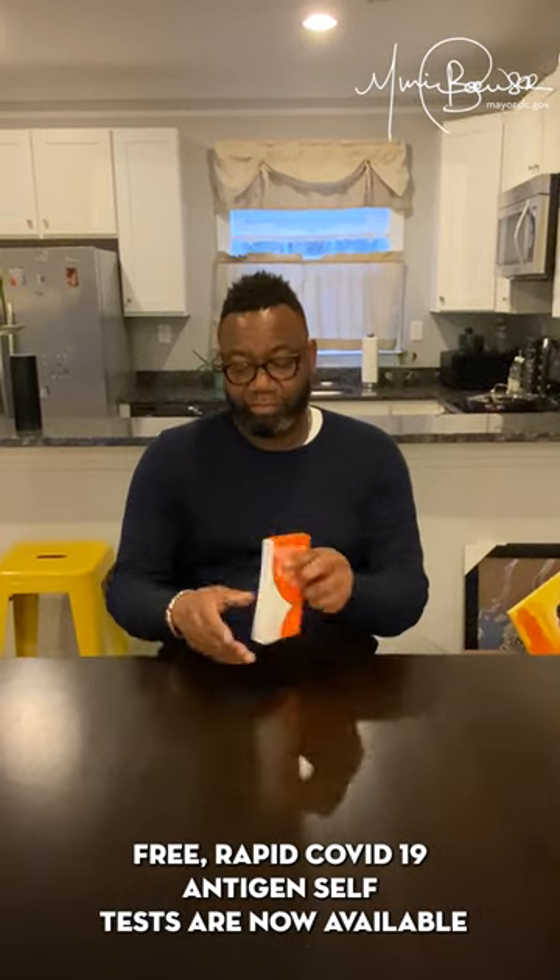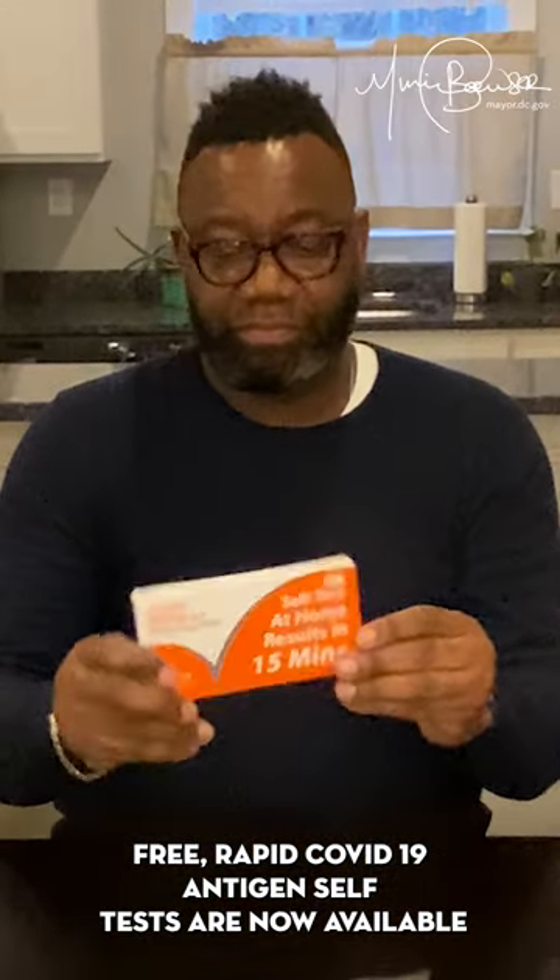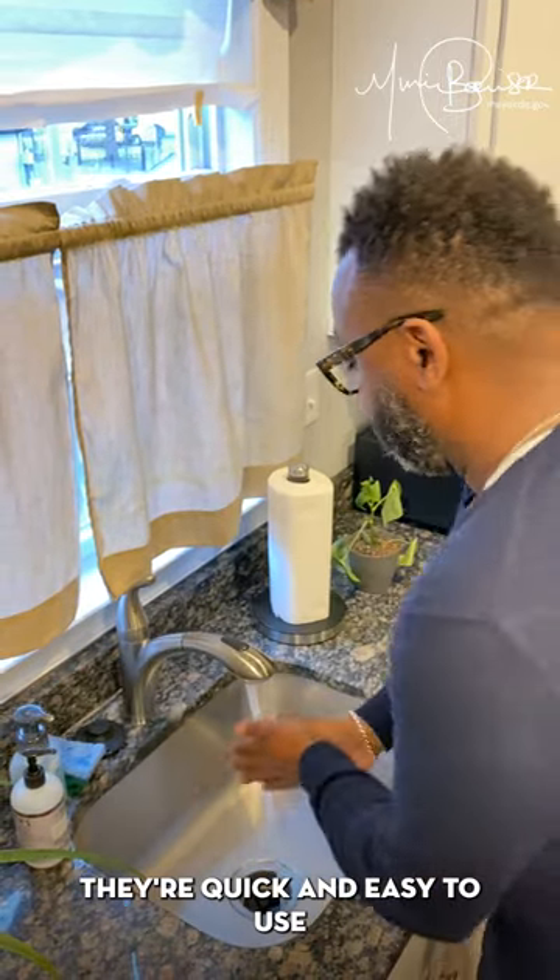Free rapid COVID-19 antigen self-tests are now available. They're quick and easy to use.